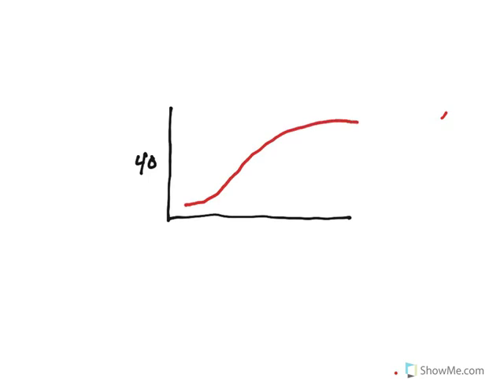So let's go to a different page here. When things are not going right, let's use red this time to show that. Here's our 40 again. Let's say we have a patient where things look like this. We could be talking about a patient with some sort of underlying disease, and let's call the value here 50 at the end-tidal.